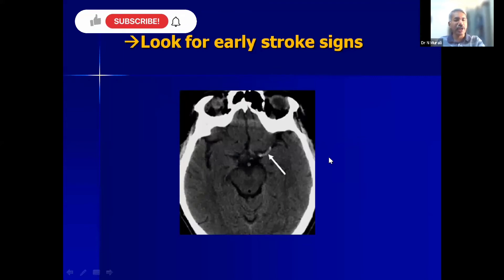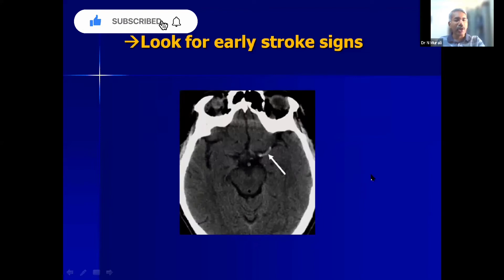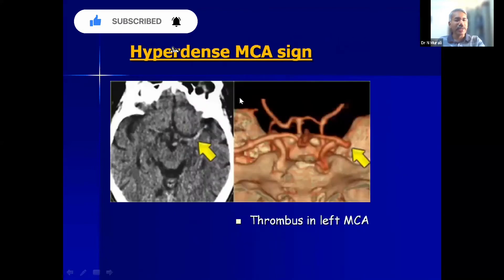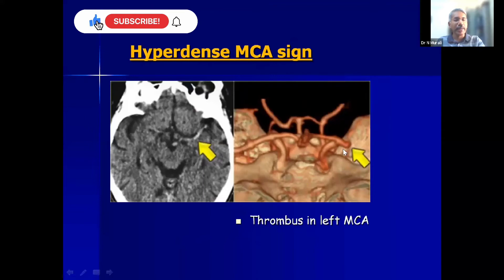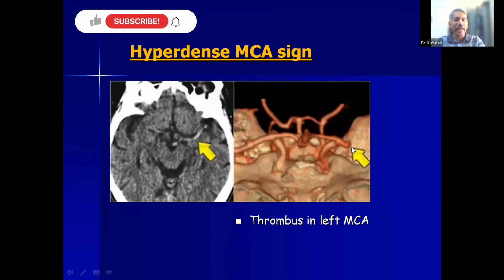Technologists can pick up early stroke signs. Whenever you see something hyperdense along the course of the middle cerebral artery on a plain scan, that is the hyperdense MCA sign. On CT angiography with 3D rendering, you can see the internal carotid artery, right and left anterior cerebral arteries, and identify that the left MCA is cut off due to the hyperdense thrombus — this is the hyperdense MCA sign.